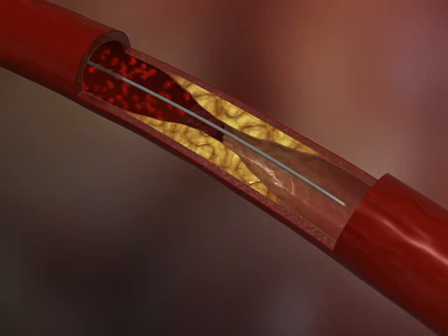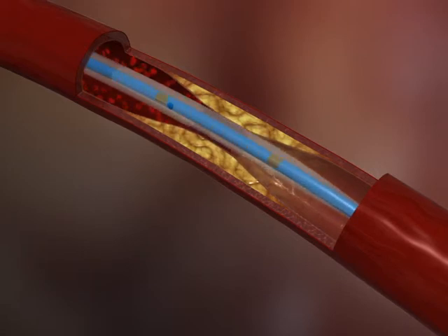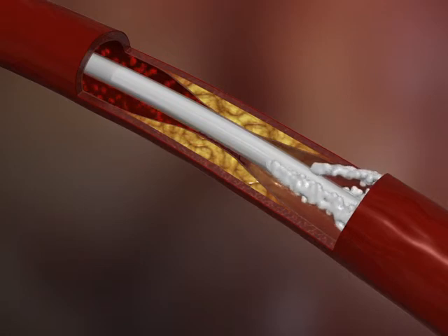After the guide passes the occlusion, the catheter is inserted past the 4th radiopaque marker. This makes it possible to rechannel the artery by means of the Dotter effect thanks to the conical shape of the Amicath, providing access to circulation distal to the occlusion through the perfusion holes. The contrast medium is then injected through the distal holes to view the distal vessel. Simultaneous injection through the guiding catheter makes it possible to view the length of the lesion.